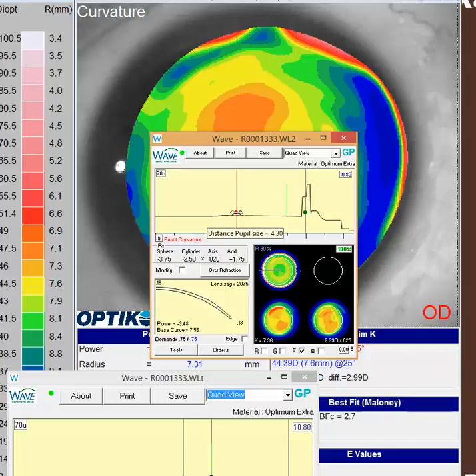Hopefully you'll find that helpful. Sounds like you're pretty close on this case. Unfortunately, you're at the nickel and dime phase, as I call it, right where you're trying to tweak a little bit on that bifocal. And as you recall, there's no perfect bifocal, so we have to shoot for that 20 happy vision sometimes. With that said, I wish you well with this case. Hopefully this will get you over that last hurdle.